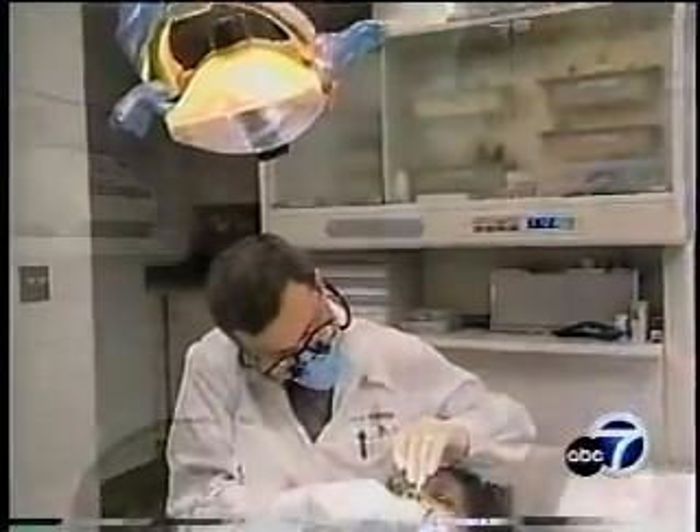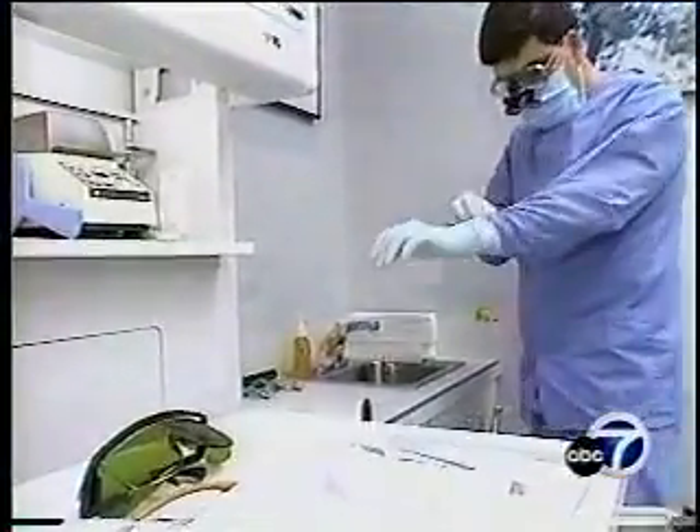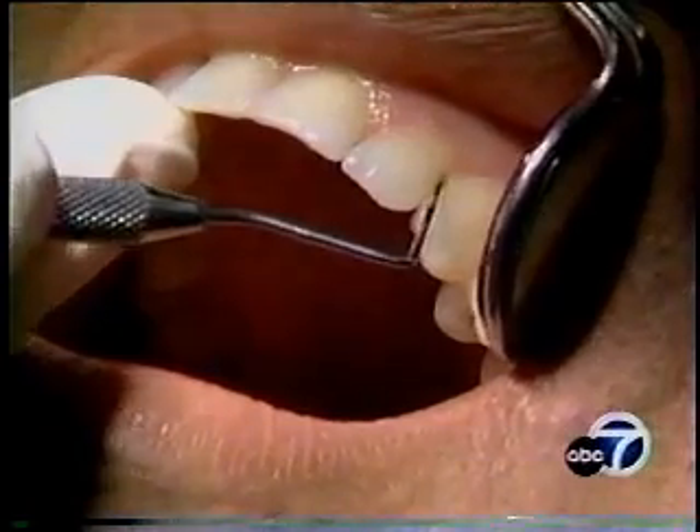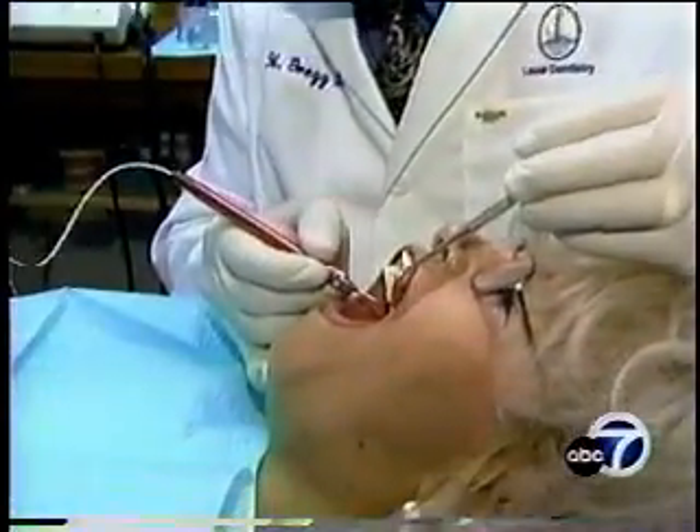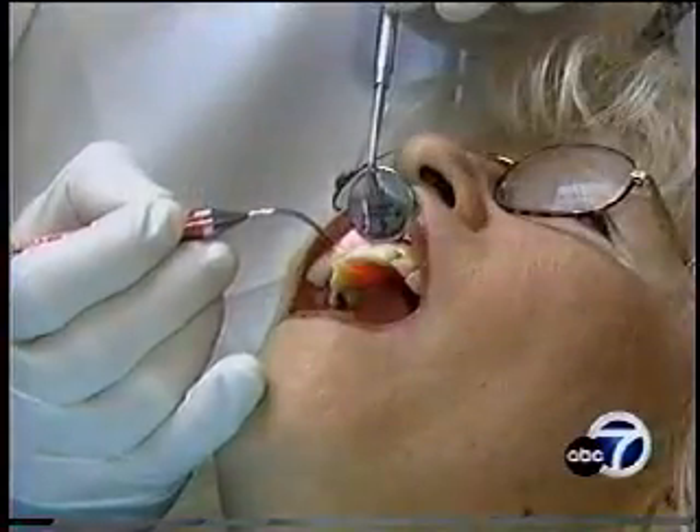Traditional treatments for gum disease can be painful, usually involving a scalpel and stitches or scraping the gums. But the laser method promises patients a pain-free way to zap away the disease. They don't hear it, they don't feel it. If they were to feel anything, they might feel a little warm.